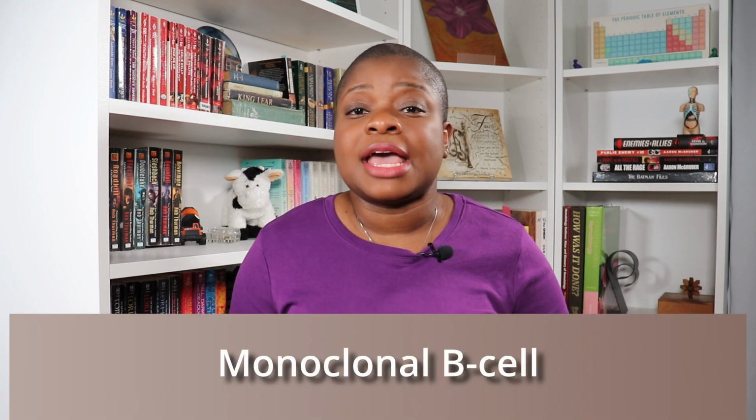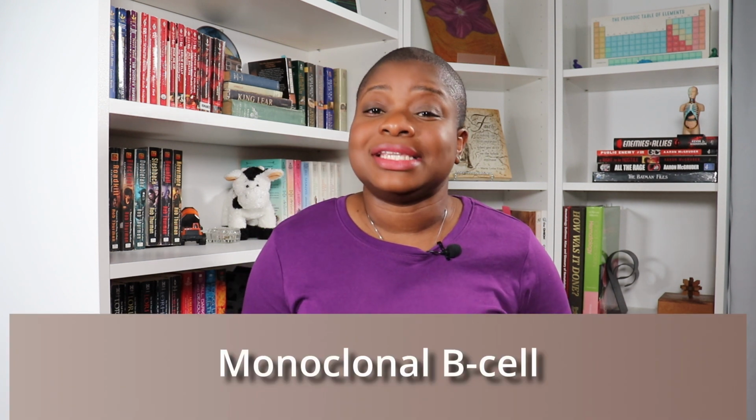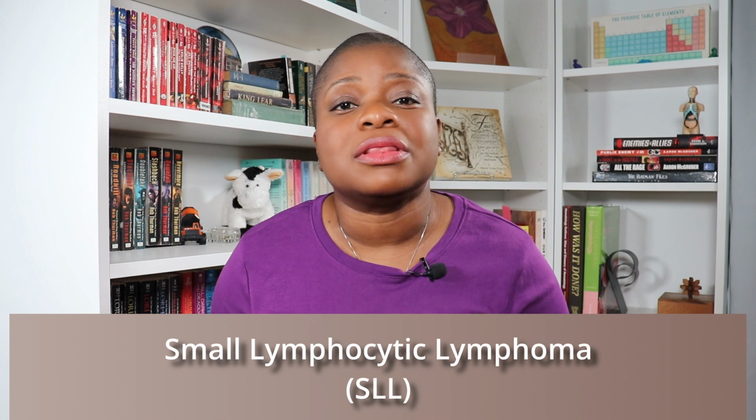What you are seeing is the classic initial presentation of chronic lymphocytic leukemia, or CLL. This is a disease of the B lymphocytes, or B cells, where one cellular clone proliferates, thus giving the name monoclonal B cell, should you see that in textbooks. Actually, this could be the initial presentation of another disease called Small Lymphocytic Lymphoma, or SLL.